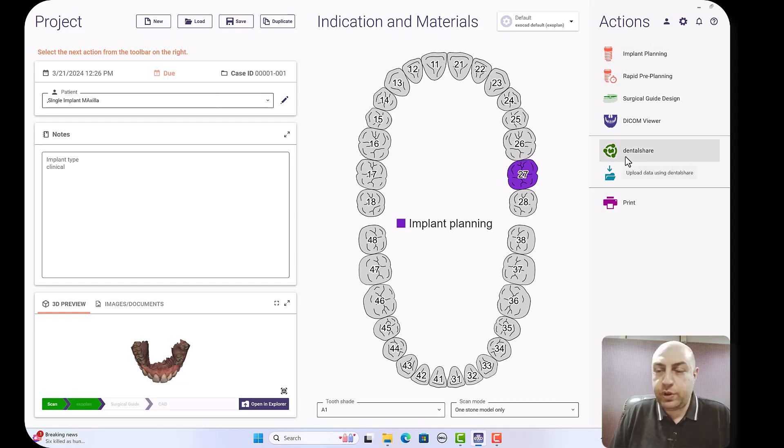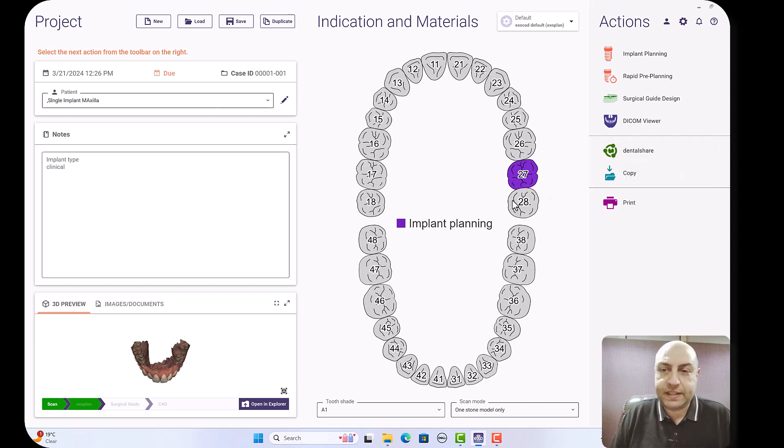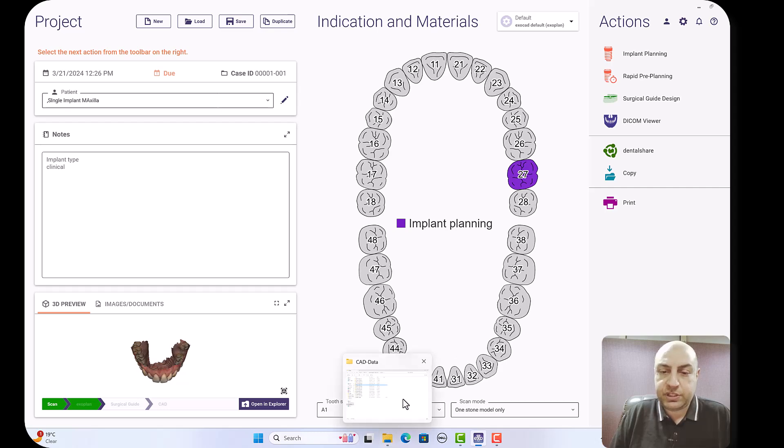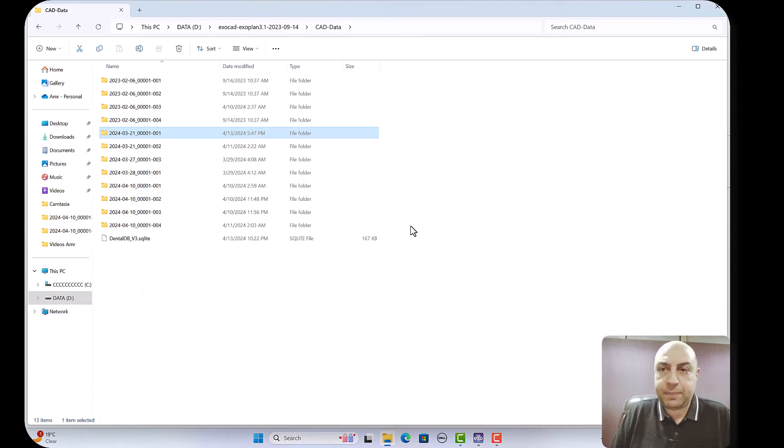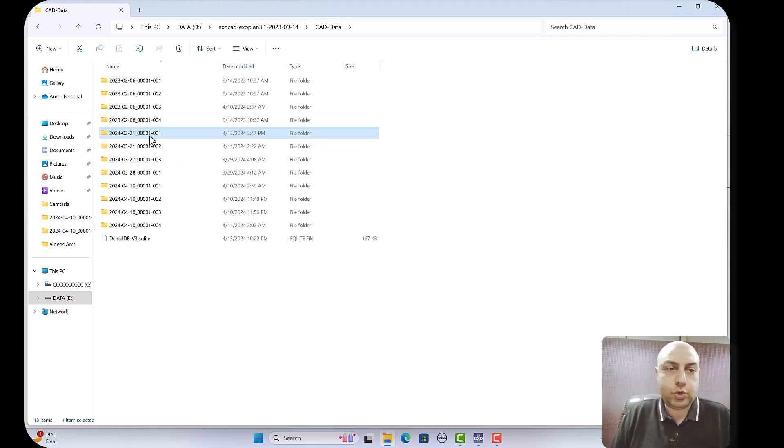So either if you're not going to fabricate the restoration yourself, you can use dentalshare or you can copy the project, send it to the lab or put it in the database of Exocad software. I will show you how.